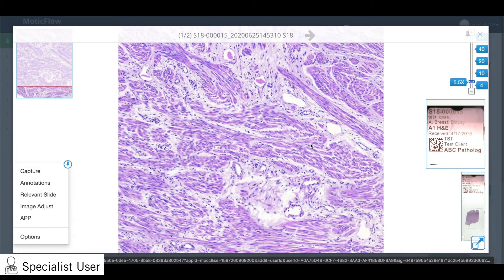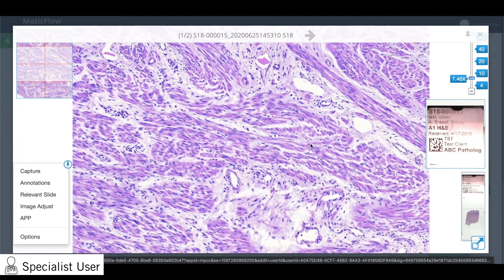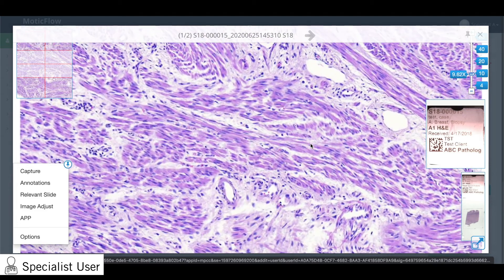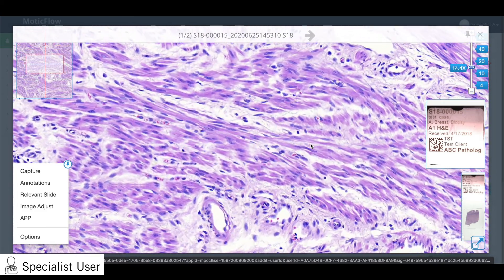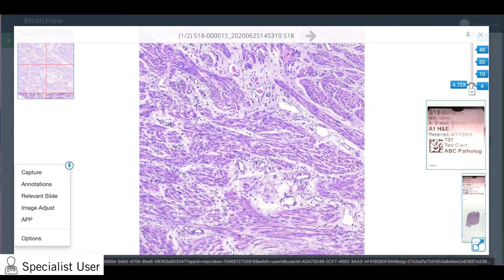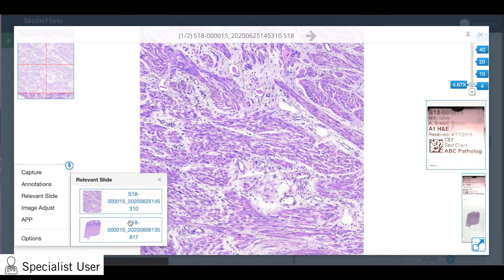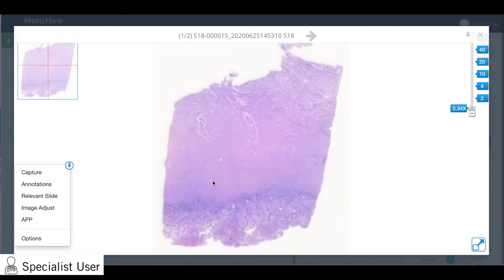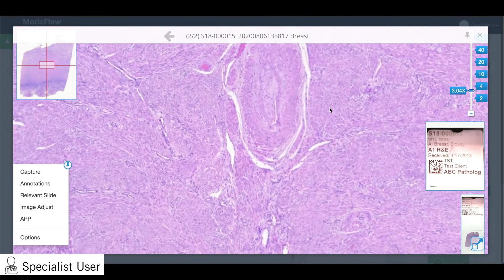To get a better view of the slide detail, zoom in and out using the slider or using your mouse wheel. In the bottom left-hand corner, you can click Relevant Slide to quickly switch to review another slide in the case.